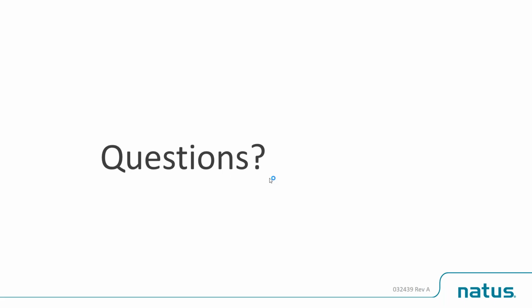I haven't. I usually limit myself to just distal to the elbow, not clear down in the forearm. And again, maybe I'm concerned about the depth of the nerve there and the amount of intensity. It sounds like it would work okay, but I had never done it. And probably, again, because of the depth of the nerve. I don't want to turn up the stimulus so much to get the deeper nerves, but on the face of it, it seems like that would be okay.